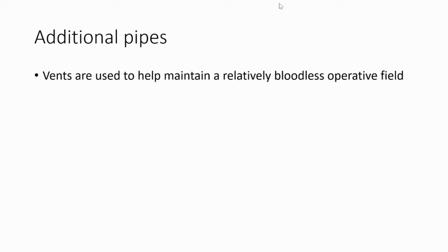And we don't have any venous pipe or any drainage pipe in the left side of the heart. It's all on the right side, because that's where the bulk of the deoxygenated blood is dripping down into. Now, you might think, oh, well, if it's just a bit of bronchial circulation, it's probably not that much. Well, you'd be wrong. It's actually 150 to 200 milliliters of blood per minute that returns to the left atrium as venous return from the bronchial circulation.